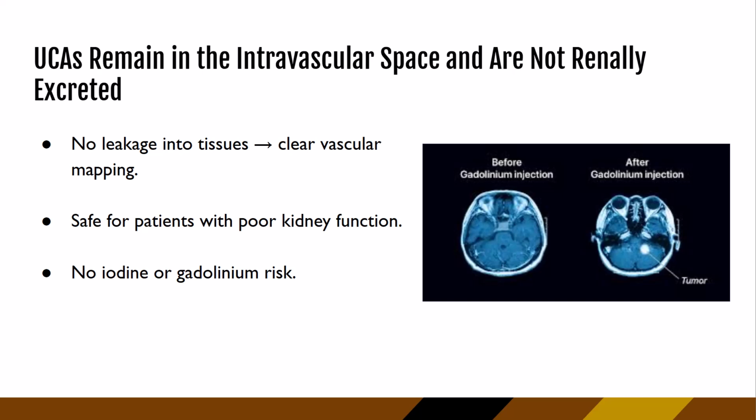And then even some of our newer microbubble agents that are being designed are going to bind to specific targets like tumor markers or endothelial receptors, which then opens the door to molecular imaging.